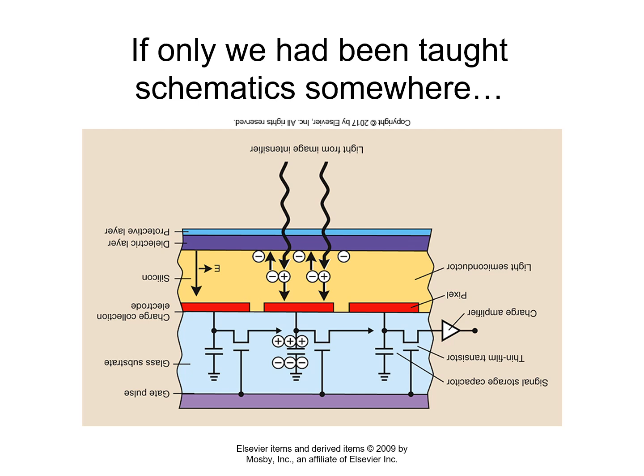And so if the electrodes and the top plate of the capacitor start to collect these positive charges, the ground will start donating electrons on the negative plate of the capacitor to hold the positive ions in place, okay? And so the capacitor starts building charge because the ground is acting as a ballast to the positively charged electrodes, okay? You have to consider the positive plate of the capacitor and the positively charged electrode kind of as one element, like an anode, okay? So those positive ions are stuck there.